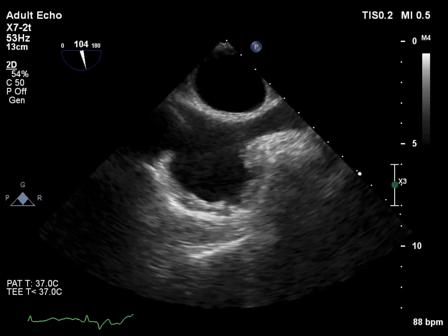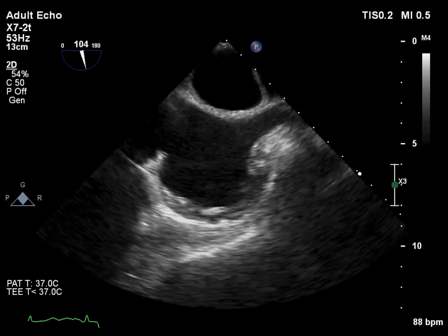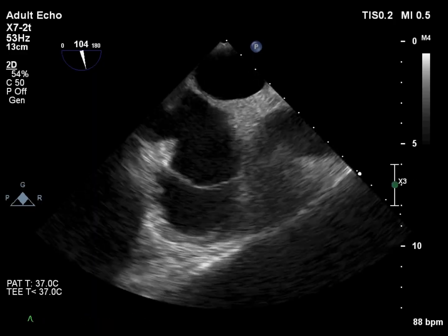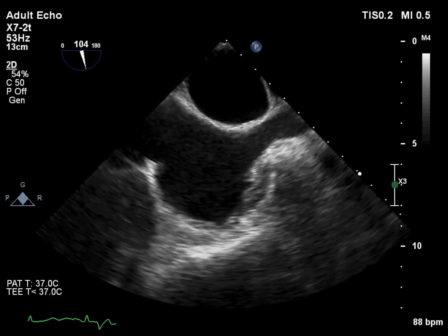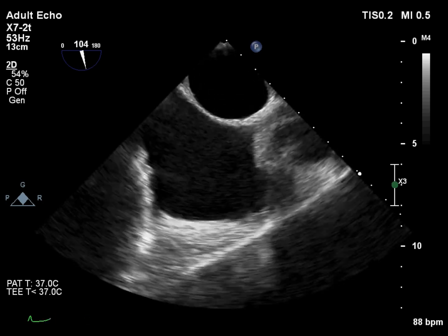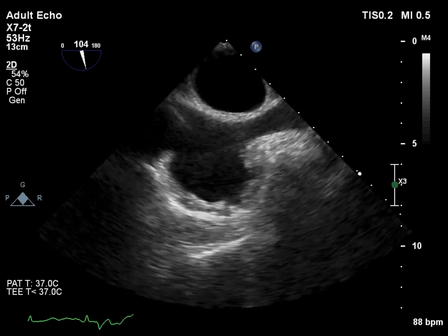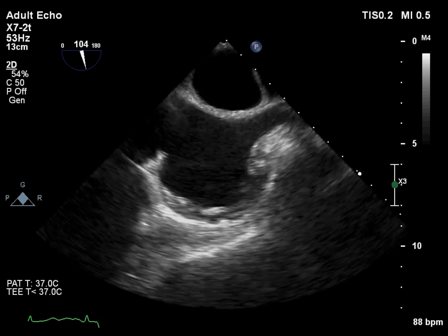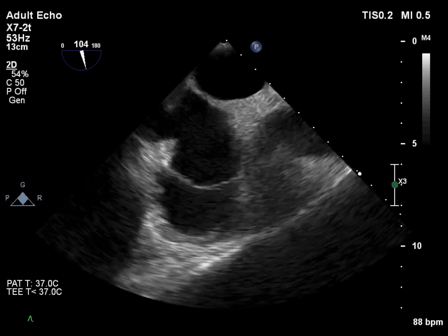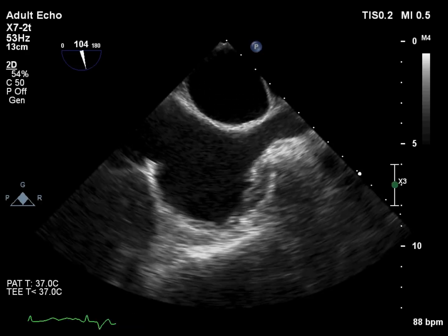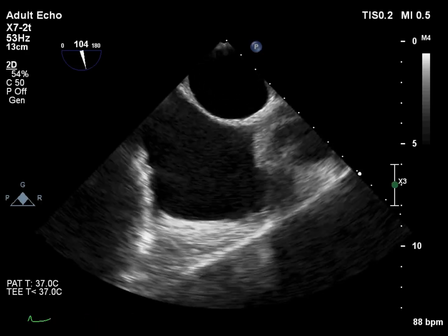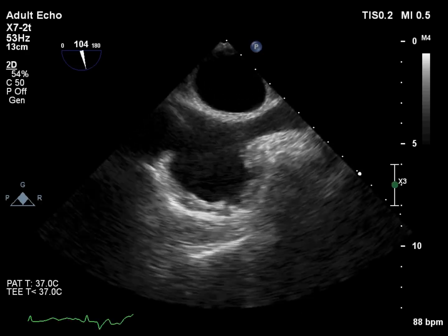This bicaval view confirms that the interatrial septum is intact and there is no atrial septal defect. However, a shunt is present. The question is: where is the shunt?